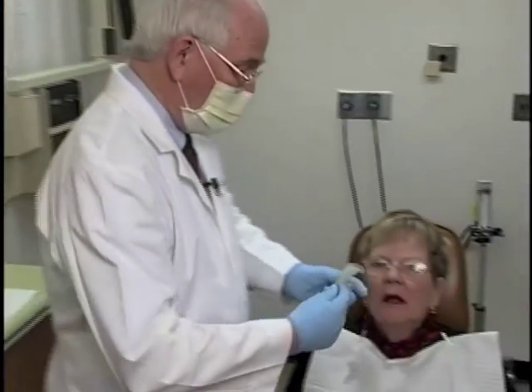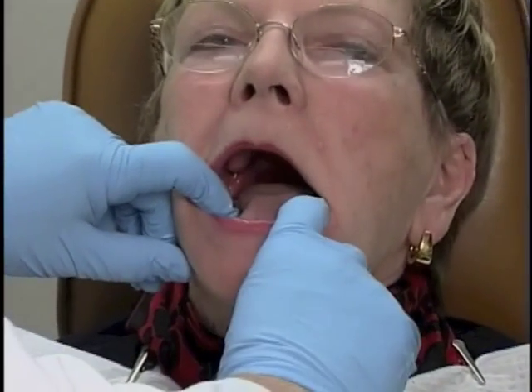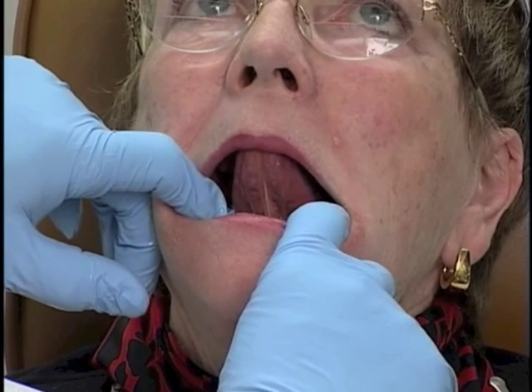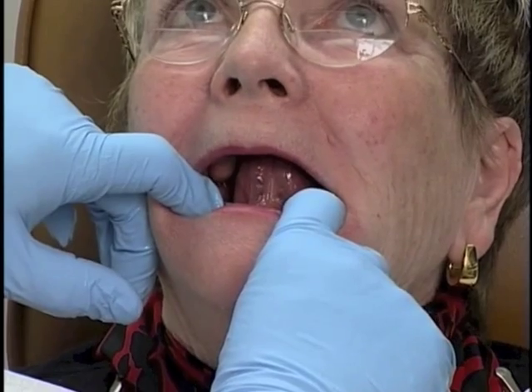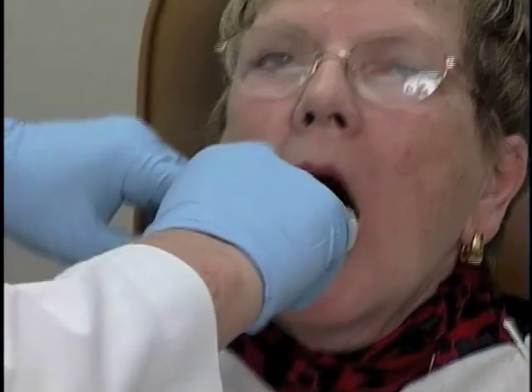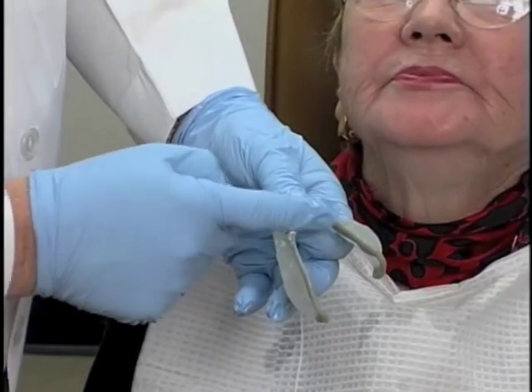And now we go to the mouth, seat the tray, and this time I would like you to put the tip of your tongue where your upper 2 front teeth should be and press the top of your tongue right against the roof of your mouth. Very good. Now relax. And now we have a very nice border molding of the sublingual crescent area.